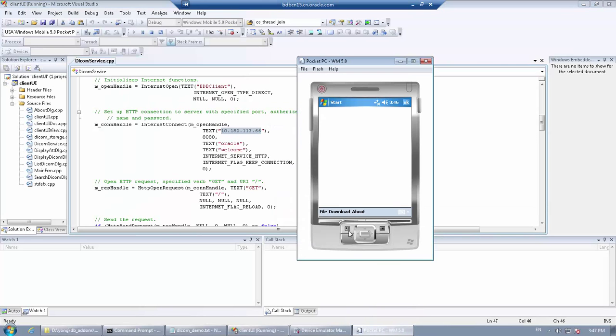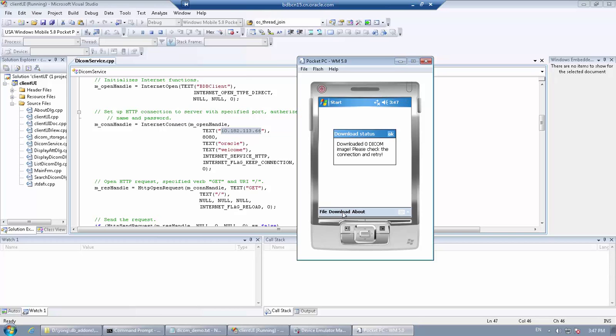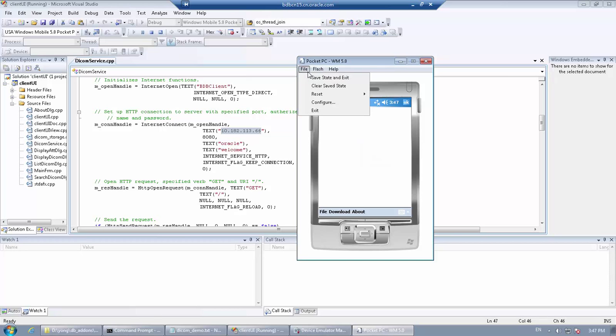After the client is started in the emulator, click Download. If you see this error message, you need to enable network for the emulator.